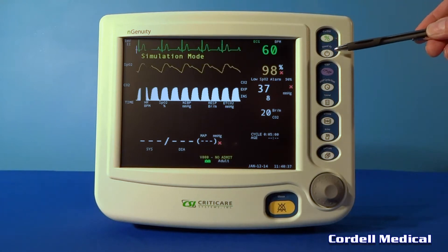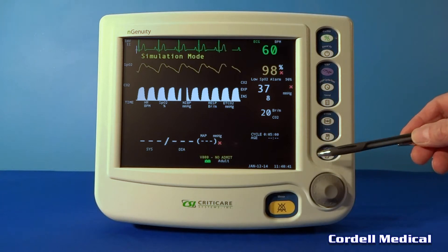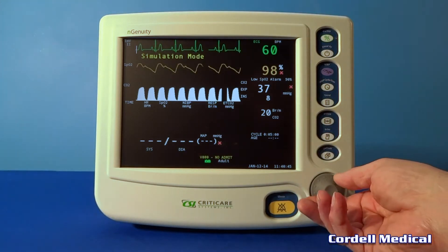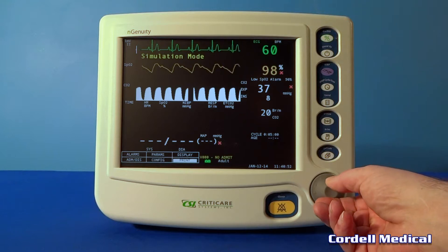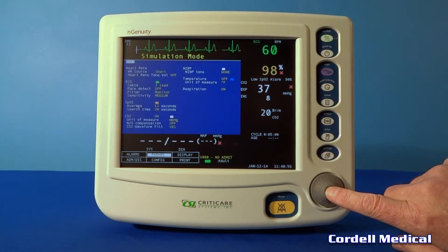The EP1 has easy-to-use menus and dedicated function keys. The rotary menu knob can be turned left or right to make selections from any of the menus that appear on the front display. The selected menu option can then be activated by pressing the knob.